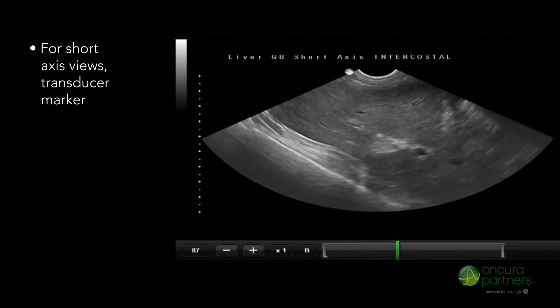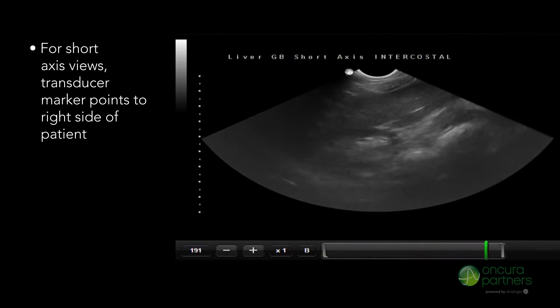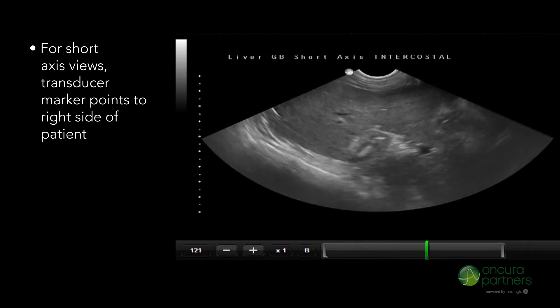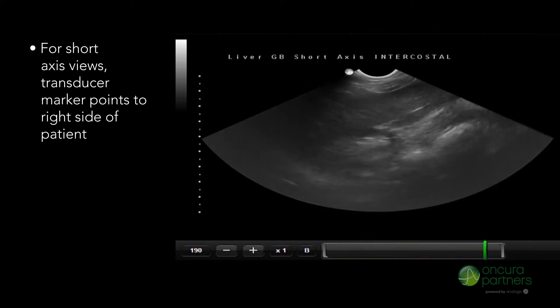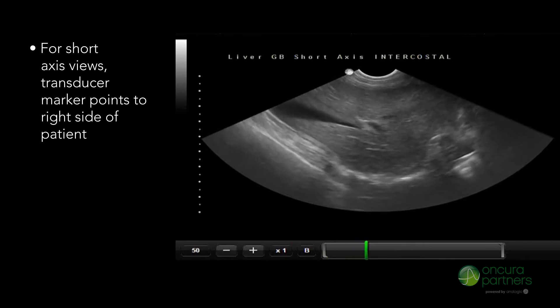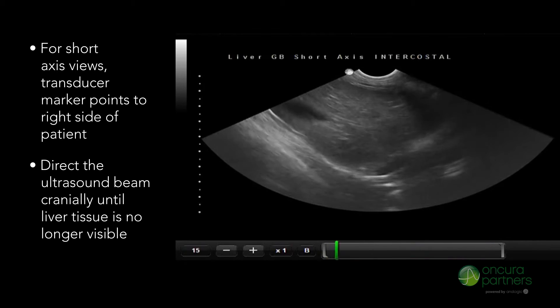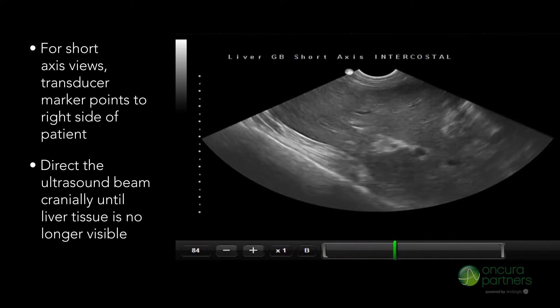To evaluate the short axis plane or transverse plane, rotate the transducer marker so it points towards the right side of the patient until the diaphragm is seen crossing from the right to the left side. Direct the ultrasound beam cranially with a fanning motion until liver tissue can no longer be seen.